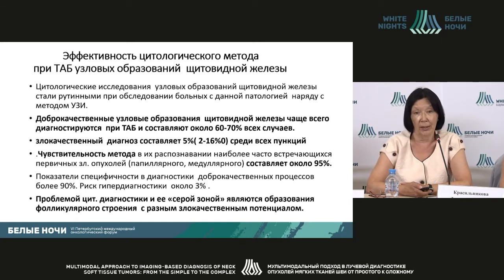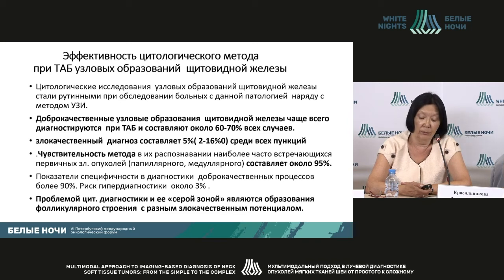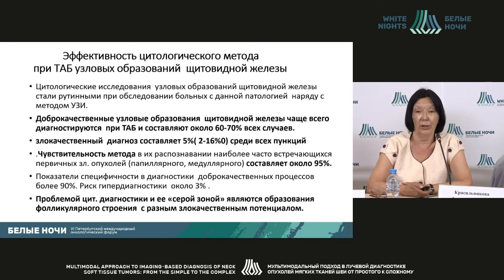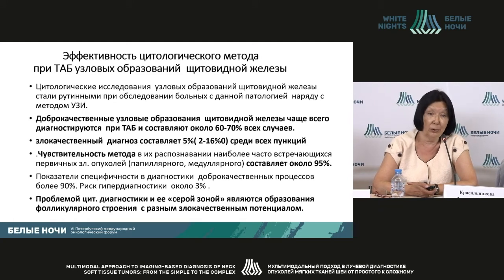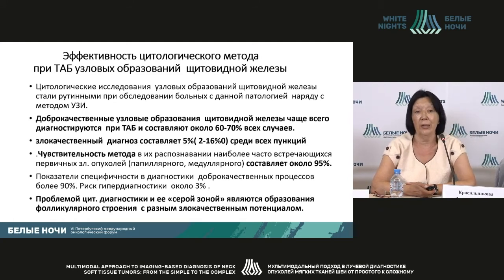What are the opportunities of the cytology method at present? We study the nodes with the cytology and the cytologist. First of all, in bigger volume, is checking hyperplasias. That makes some 60-70% of all the cases. They're benign. And malignant tumors are only about 5% of all the punctions.